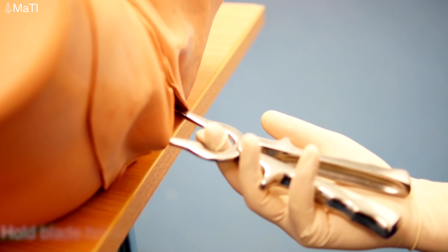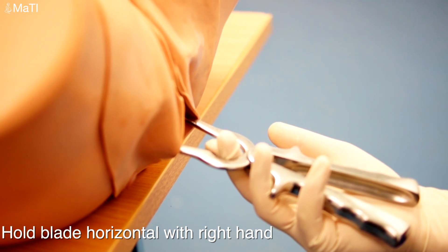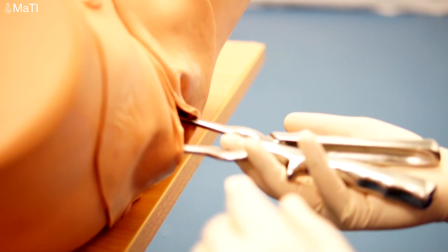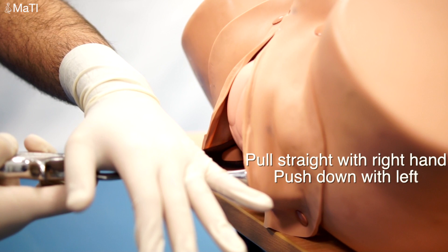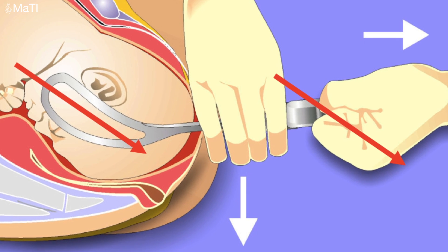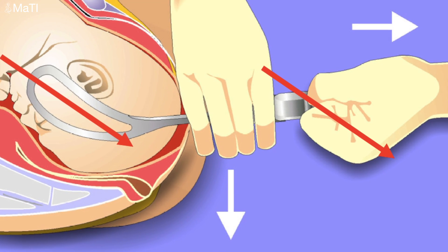Hold the blade horizontally with the right hand if you're right-handed, and pull straight with that hand and push down with the left, generating a diagonal force downwards. This diagram shows the correct hand placement, the direction of pull with white arrows, and the overall direction of force with red arrows.